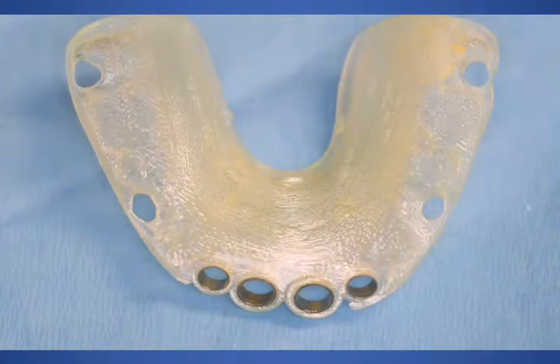We have a tight situation, 2 laterals and 2 central incisors, but we were able to use the computer to properly angle and position our dental implants, so we knew that we could use a surgical guide in this situation to ideally place the implants. If we were unable to use this, or if we were unable to place the rings or to stabilize them correctly, we would probably do this case freehand.